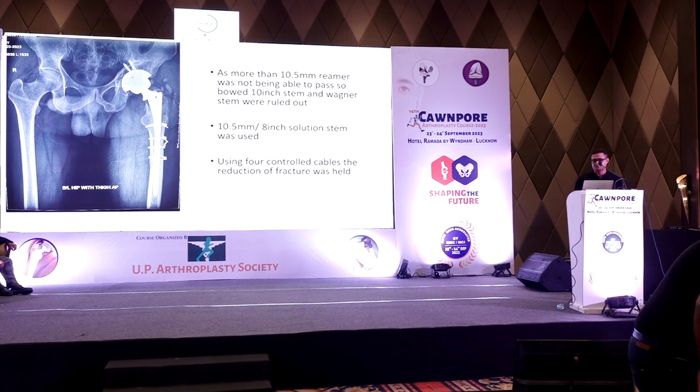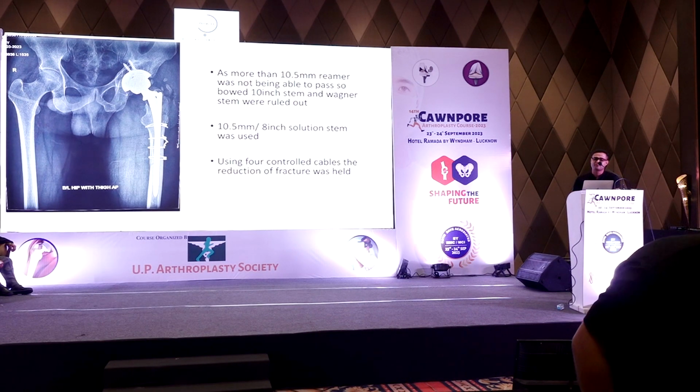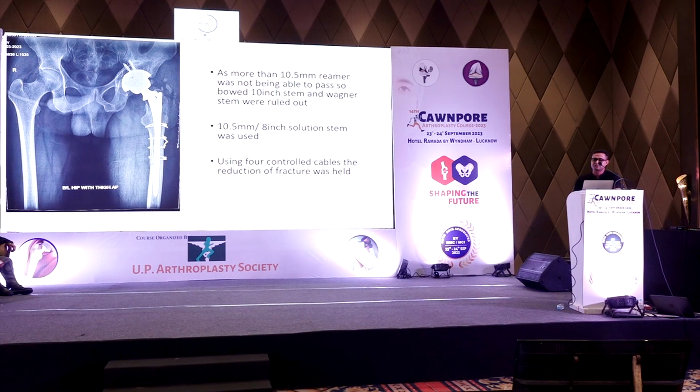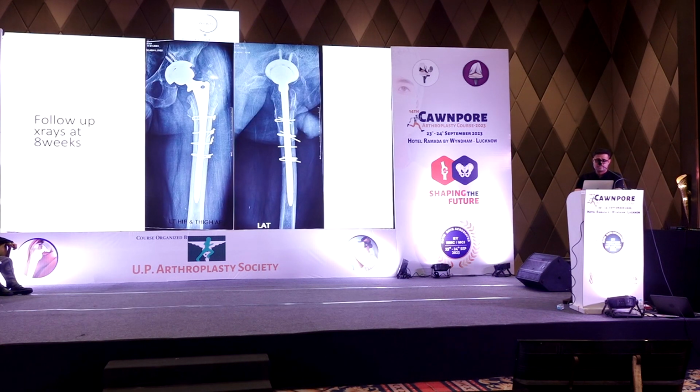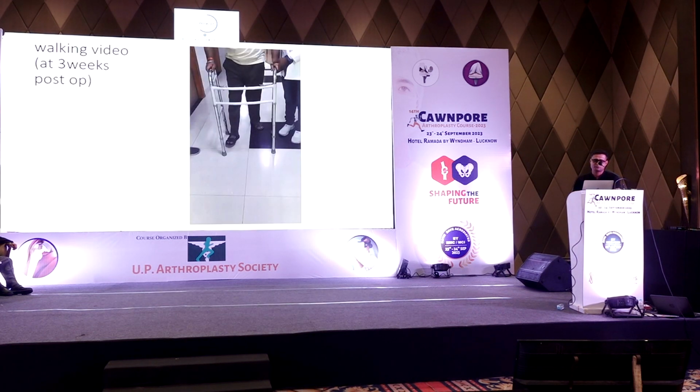Because for Wagner, we had no availability of a lesser size stem, and a 10.5 mm 8-inch Solution stem was used with 4 control cables. Basically the third cable is the SS wire, which was previously held while reaming the canal. So this is the post-op X-ray, and post-op X-rays, AP and lateral views. Follow-up X-ray at 8 weeks. So this was the walking video.